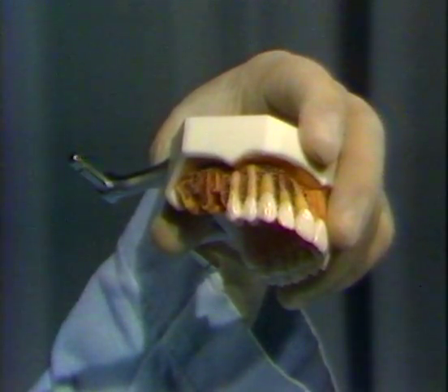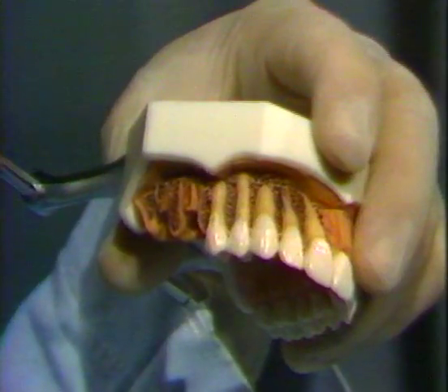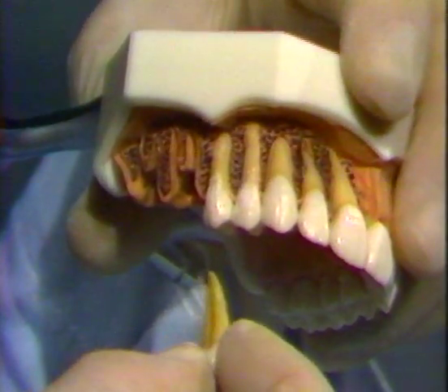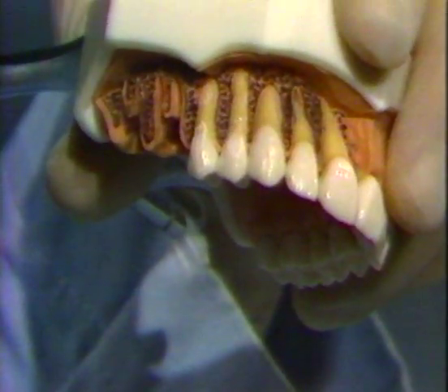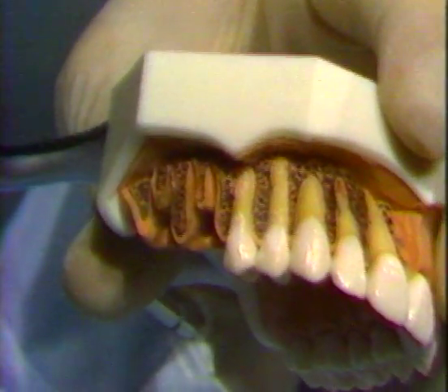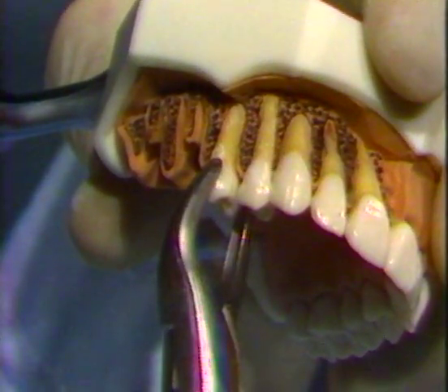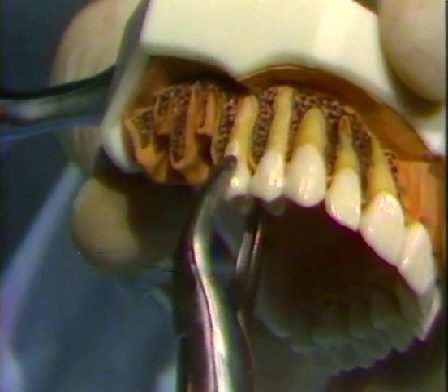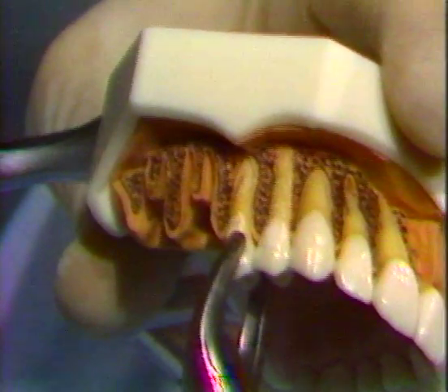Next to be removed is the maxillary second bicuspid. This is usually a single-rooted tooth. After the forceps are seated at the neck of the tooth, the first movement is to the buccal side. This is followed by movement to the palatal side. A slight mesio-distal rotation and downward movement and delivery.